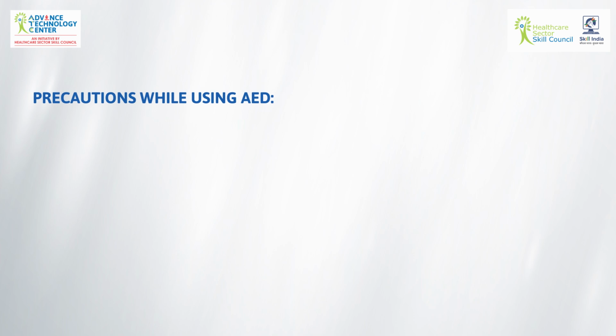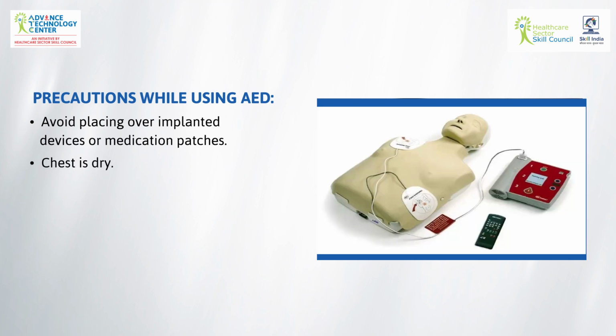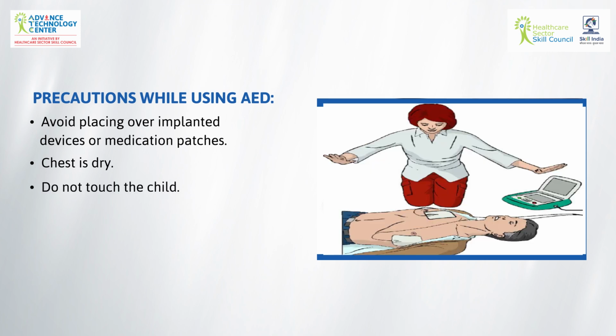Precautions. While using AED, avoid placing AED pads over implanted devices or medication patches. Ensure the chest is dry before applying AED pads. Do not touch the child while the AED is analyzing or delivering a shock.